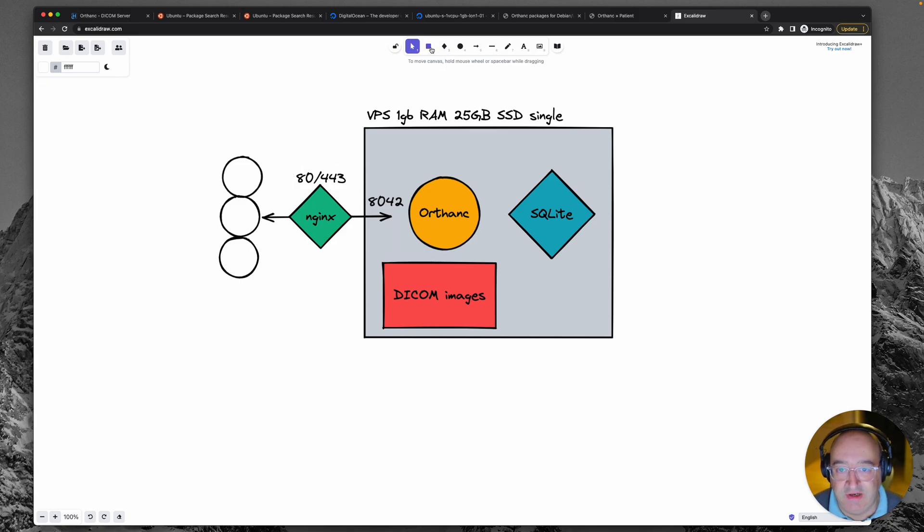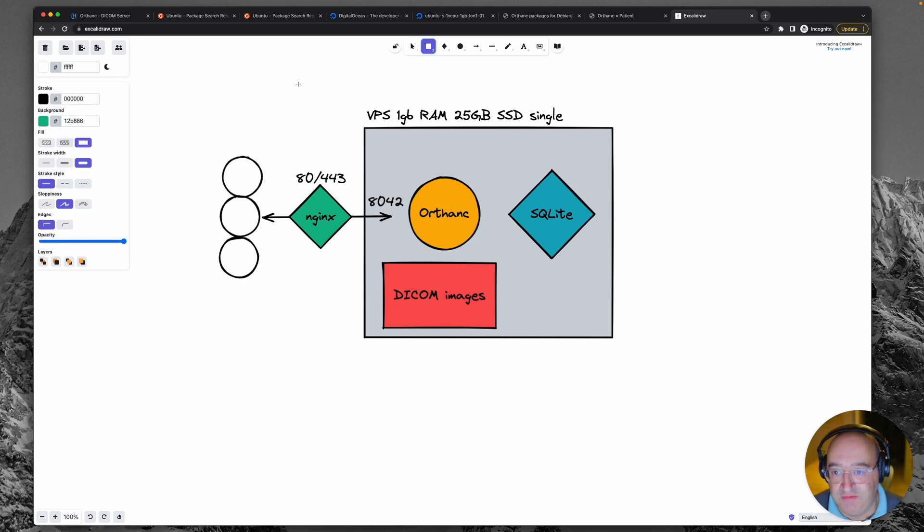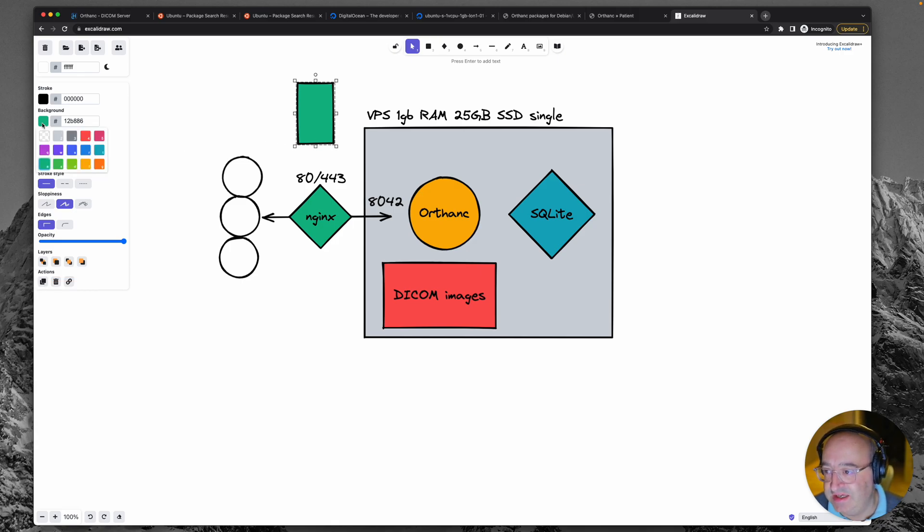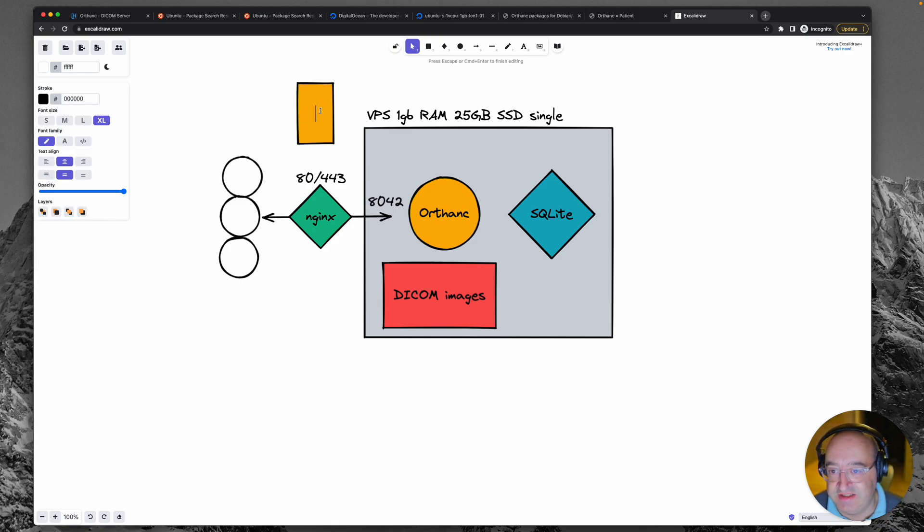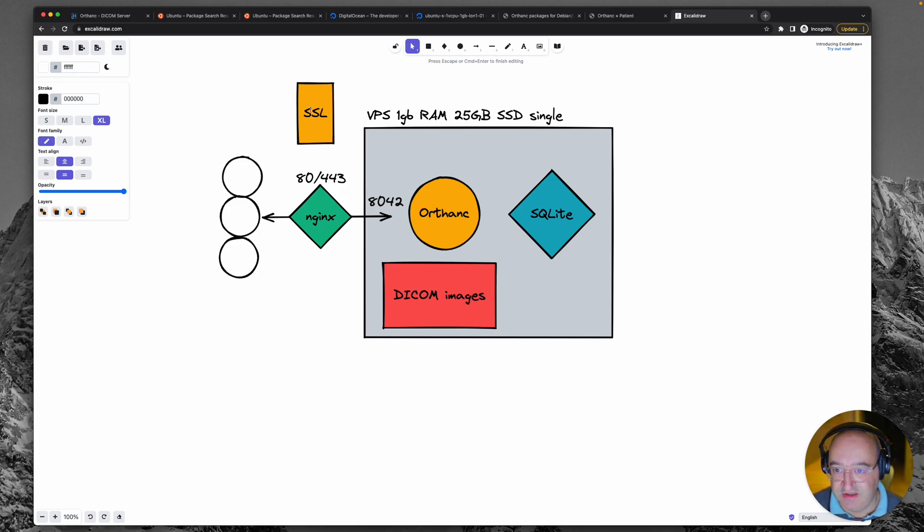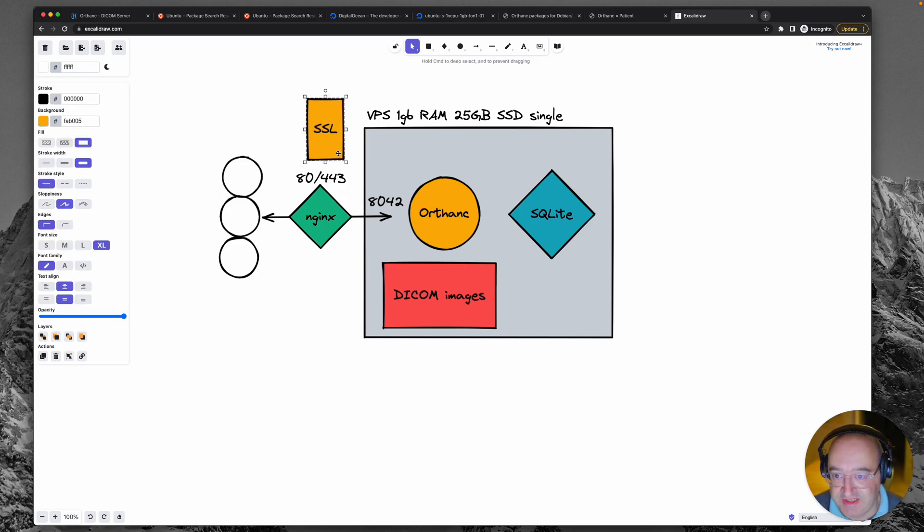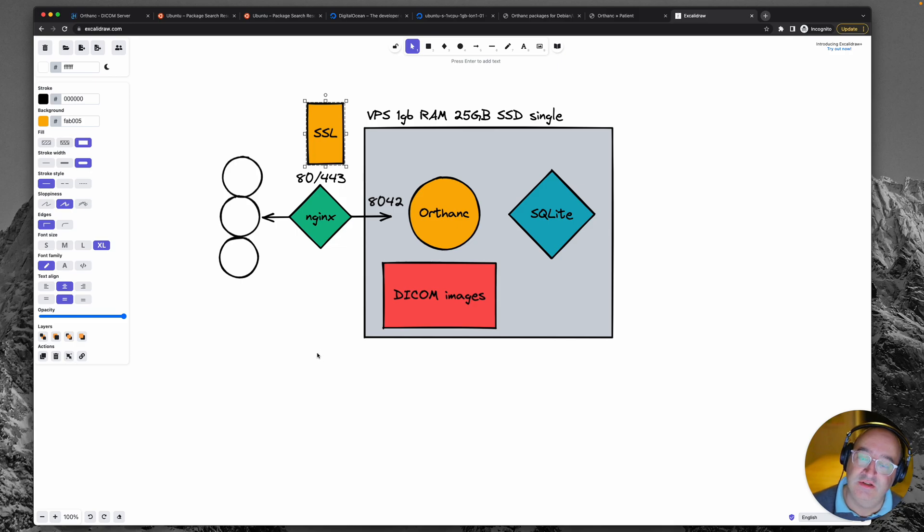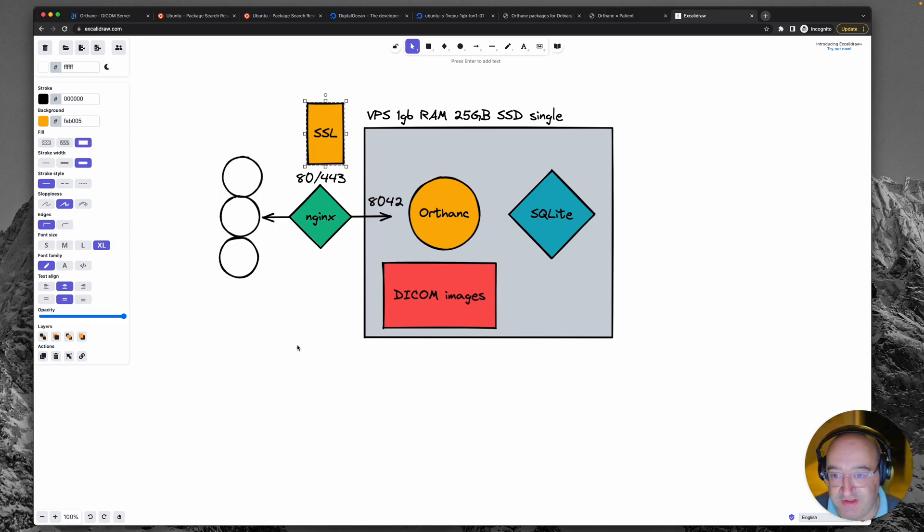Now the great thing about port 443 is it's the one that you get SSL certificates serving apps on. So we will be putting an SSL certificate there to secure our inbound and outbound traffic.